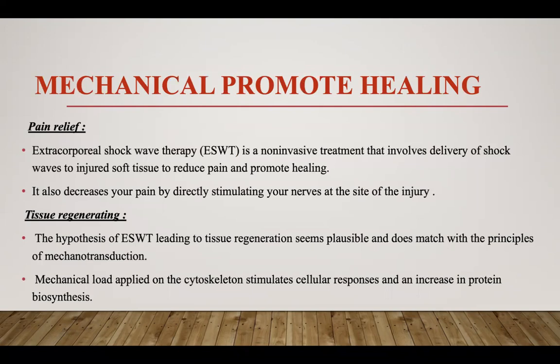Extracorporeal shockwave therapy is a non-invasive treatment that involves delivery of shockwaves to injured soft tissue to reduce pain and promote healing. It also decreases your pain by directly stimulating your nerves at the site of injury.